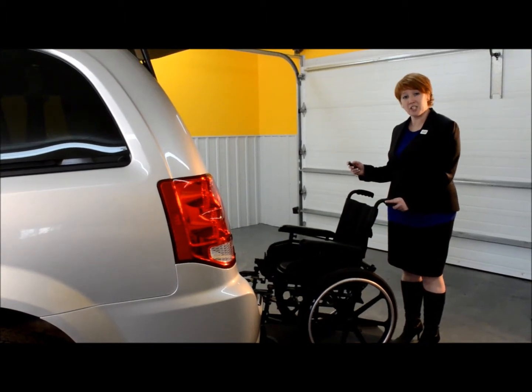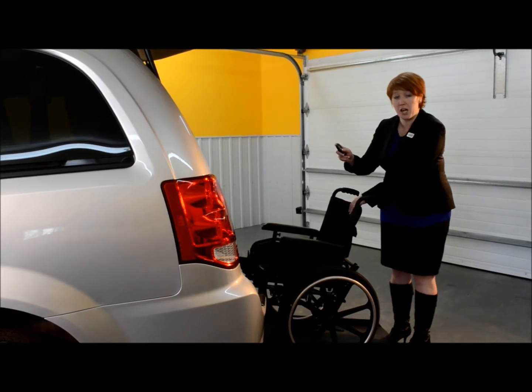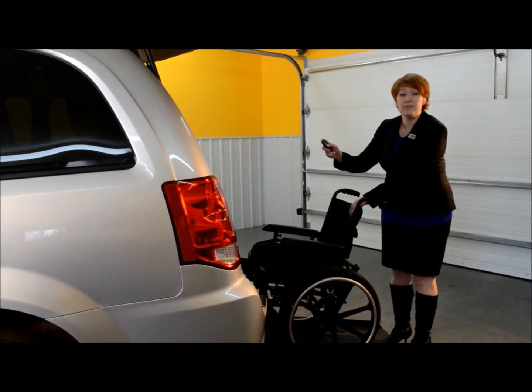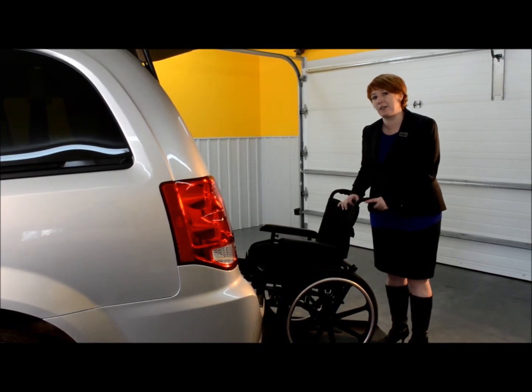The release function actually has a safety on it. If you accidentally hit release while you're seated in the chair and there's weight on the cable, even though you hit it, it will not release. It will always hold tension as long as there's weight on the cable.